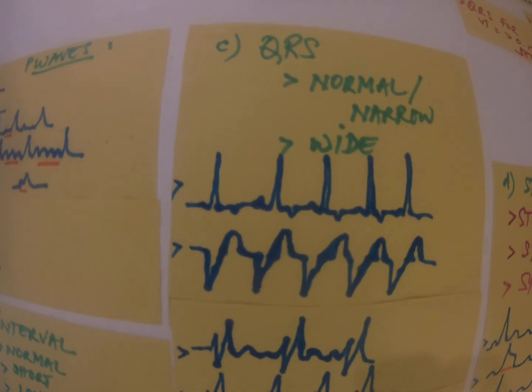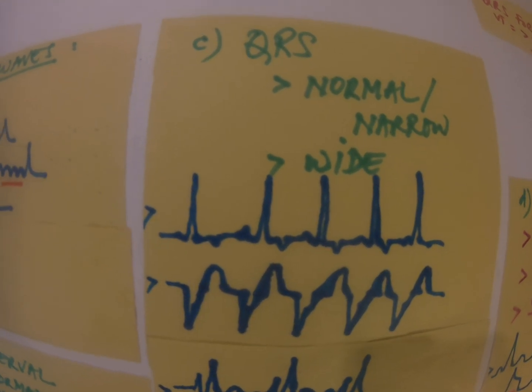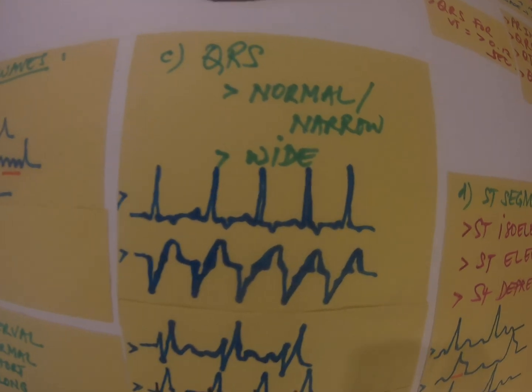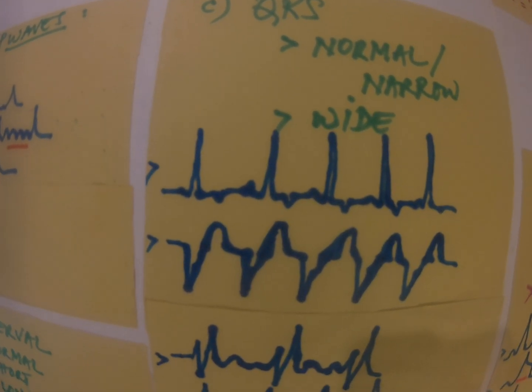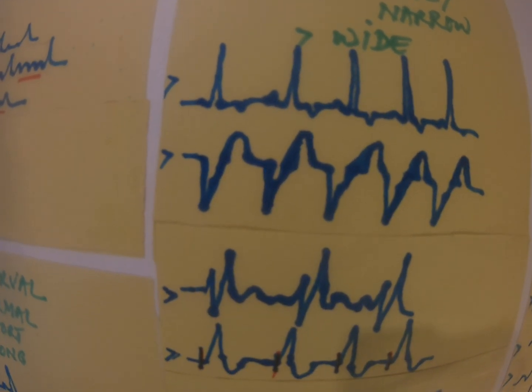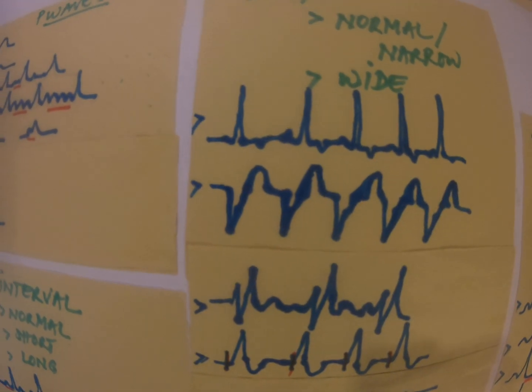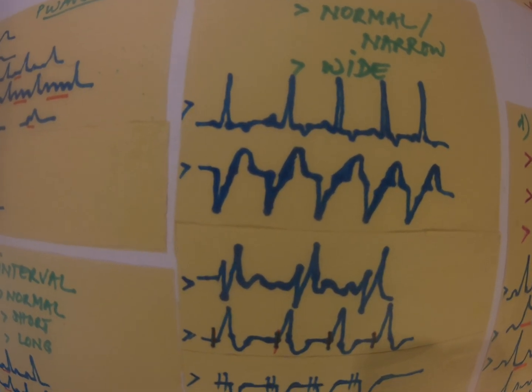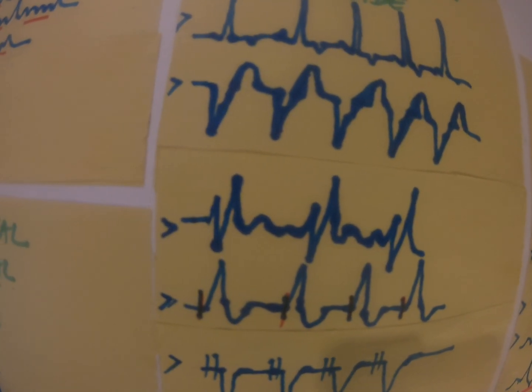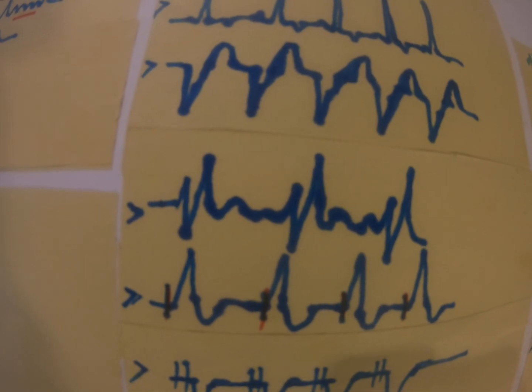Okay, so usually with bundle branch block, you look at your V1 or V6. And if it is a left bundle, rabbit ears, you see that in V6. And then here, you could have also right bundle branch block. And that is more prominent in V1. Sometimes you see a QRS that is with a spike. Okay, that is a paced QRS.